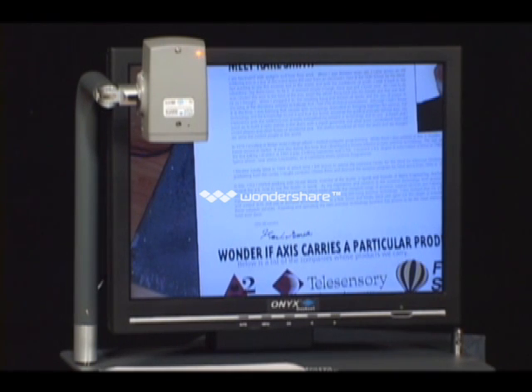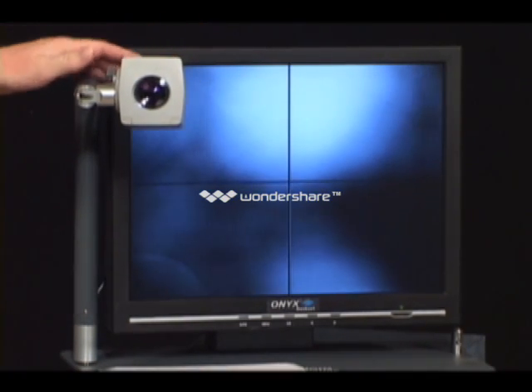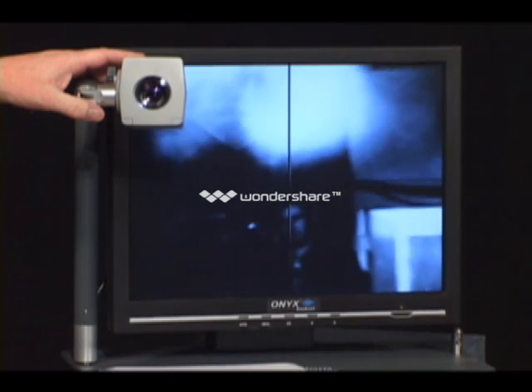It does not have an XY table, which means that it is a little harder to move bigger objects around, such as large books. The advantage to this unit is this. Again, it's portable, but also you can point it around the room. So let's find something, and maybe point it at the clock. Heather will beat us if we point it at her all the time.